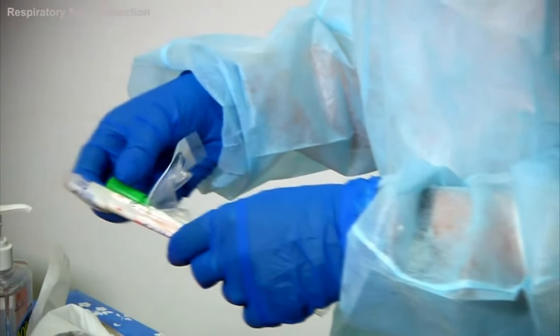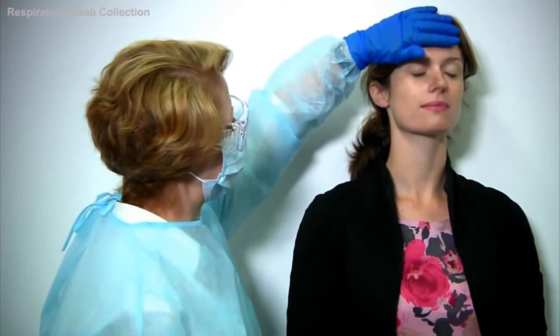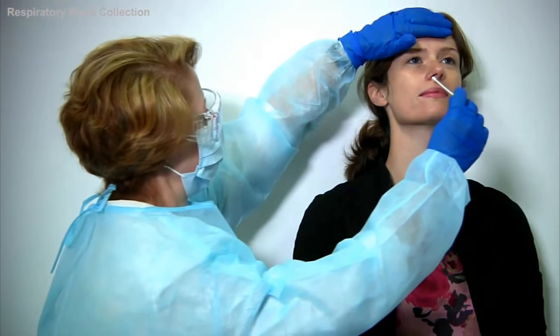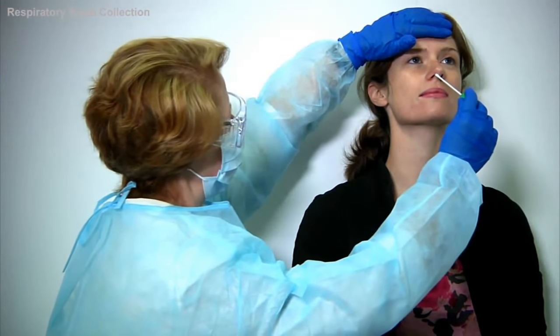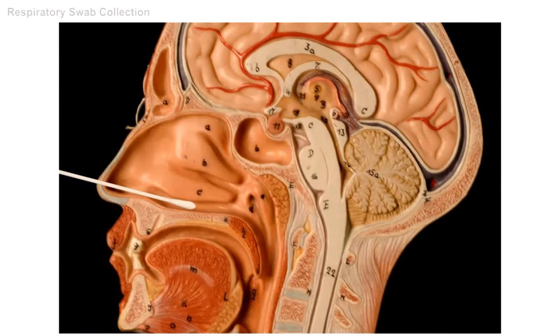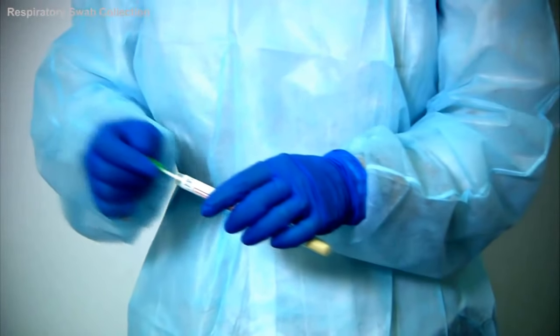Standing to the side of the patient — not in front, as they may sneeze on you — place your non-dominant hand on their forehead. Insert the swab two to three centimetres horizontally into the nostril. Place sideways pressure on the swab to collect the cells from the midline nasal septum and rotate it two to three times. Carefully place the swab back into the collection tube.